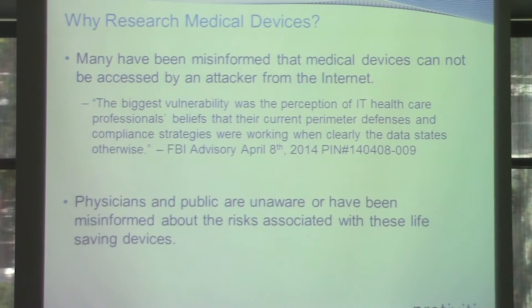Secondly, the first part of my research was really focused on actual device-specific issues. What we found, as I said, is that a lot of these things were very simple. It rolled up into 3 or 4 components: weak hard-coded credentials, unencrypted web services, systems that you couldn't patch. It wasn't really anything advanced that we had looked at.